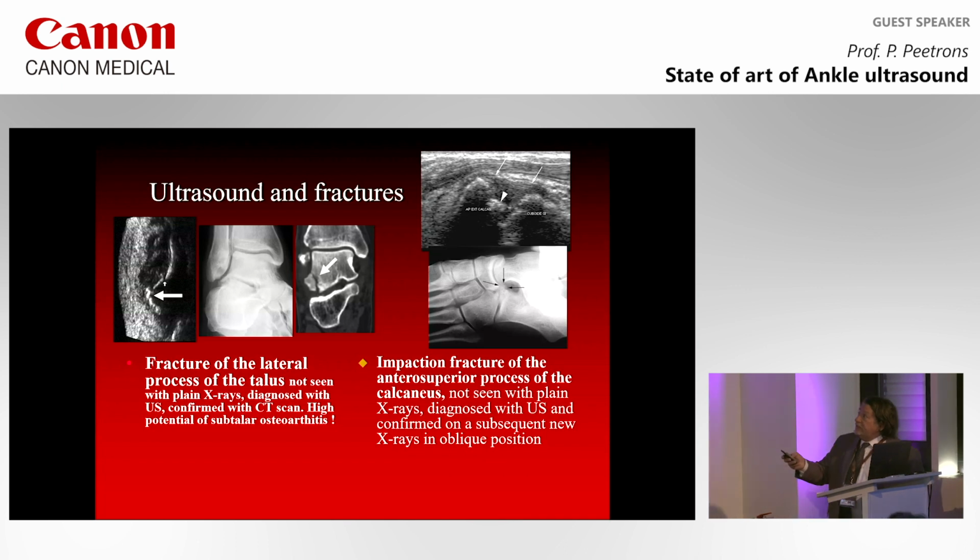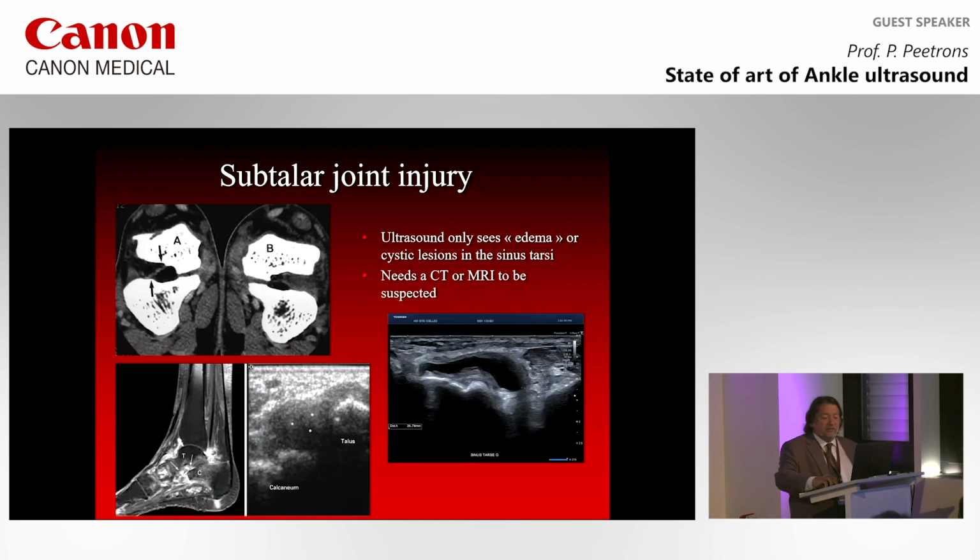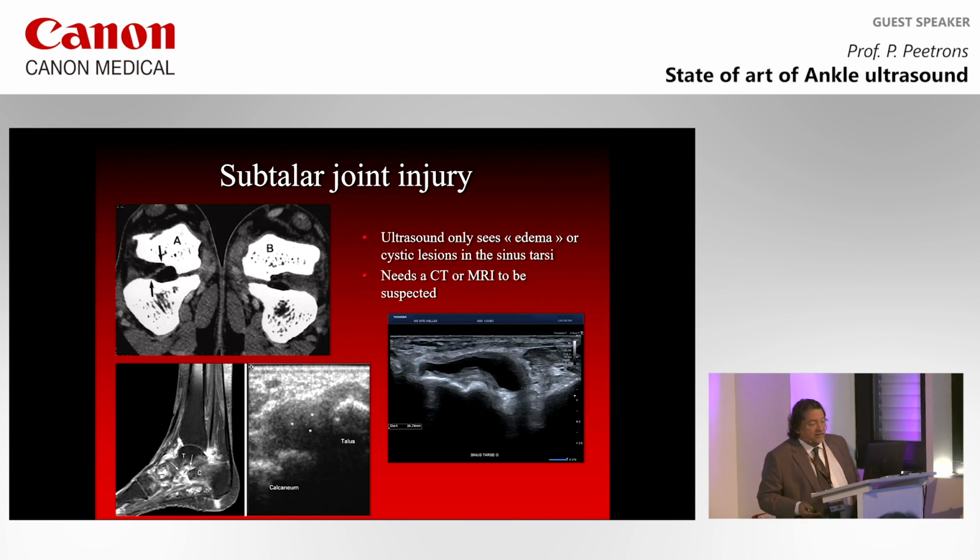And I put my probe there, and I see the fracture of the lateral part of the talus, for example. Or I see the fracture of the anterior superior process of the calcaneus, which is very, very difficult to see in X-rays, as you know. So this is very important. We are in front of the patient. We have to discuss with the patient.